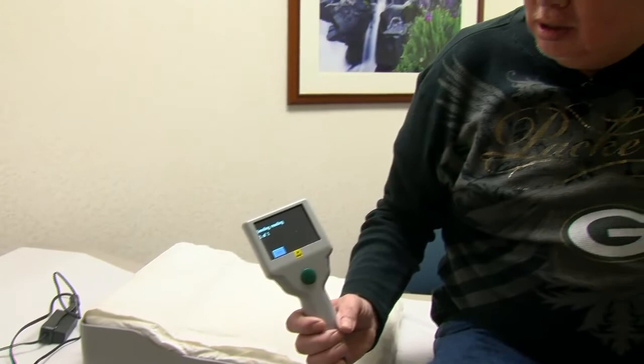Dr. Schmidt says it's a way to stay on top of any pressure changes before symptoms occur, and Jauhn ends up back in the hospital. Because sometimes the readings change before patients have symptoms. Dr. Schmidt says studies have shown patients who are using CardioMEMS have had fewer hospitalizations. Jauhn hasn't been back to the emergency room since, or felt ill.